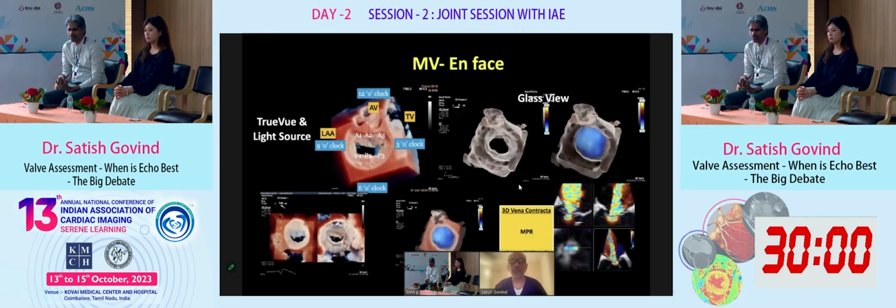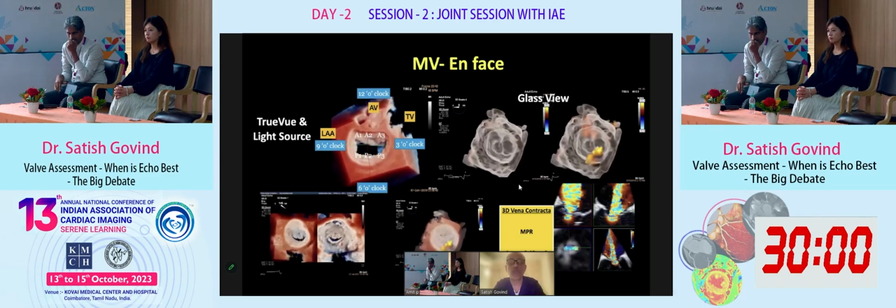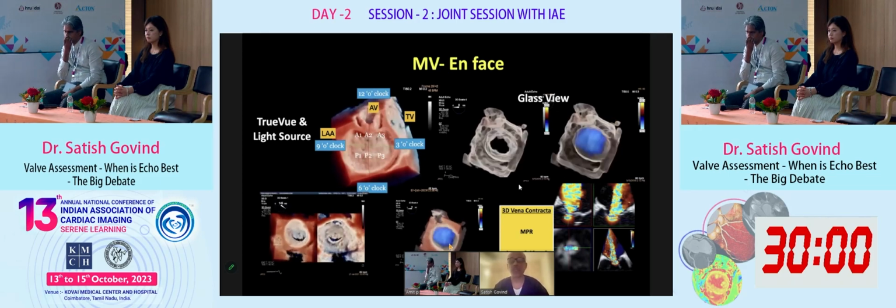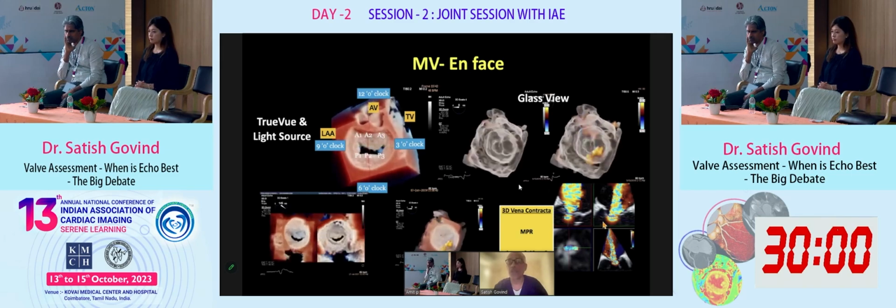And what has really been a game changer and changed the entire horizon, to look at the perspective of TE itself, is the 3D. So you can see the excellent images that are provided, and this is where it has really made a difference. So you can look at individual segments, you can look at the anatomy very clearly, you can look at both from the atrial side as well as the ventricular side, and you can look at the regurgitation as to where exactly it is coming from. So you can pinpoint it, I can use the MPR, and you can isolate it, and you can have the exact vena contracta area also.